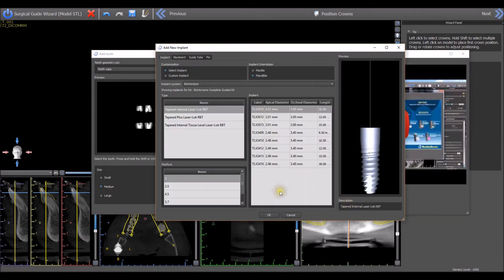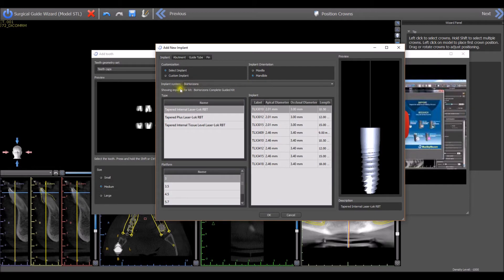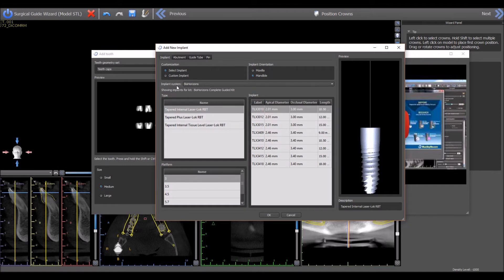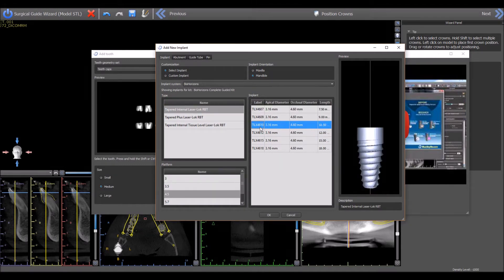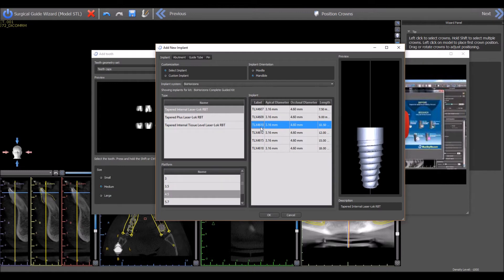Here, the software will only show the BioHorizons implant system and will only show the implants compatible with the complete BioHorizons guided surgical kit. The user should select the relevant implant and then continue with the wizard process flow.